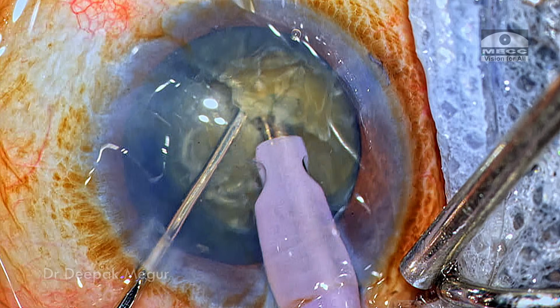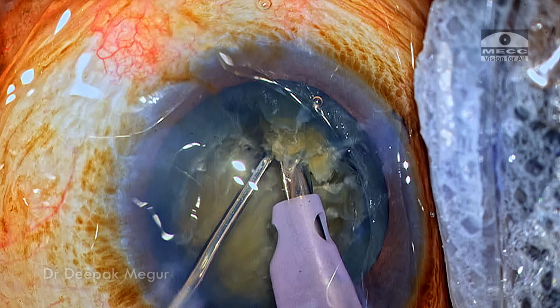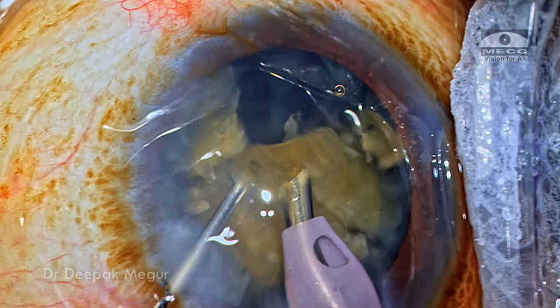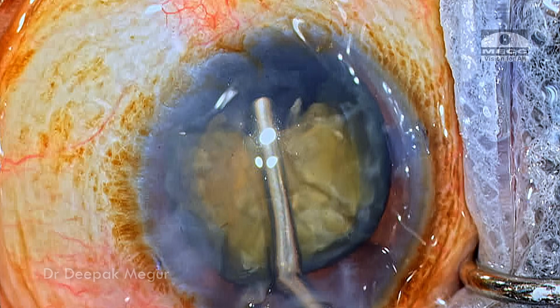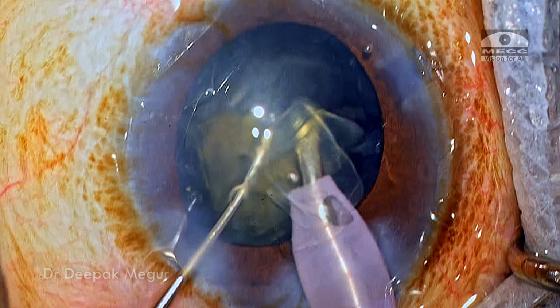Now the nucleus management is being done. The nucleus is slightly dense, so I'm going to be a little bit slow, and the nucleus is broken down into many fragments and then aspirated out. I'm using a repeated bolus of OVD to protect the endothelium and keep the capsular bag and the anterior chamber formed as the nucleus is being emulsified.